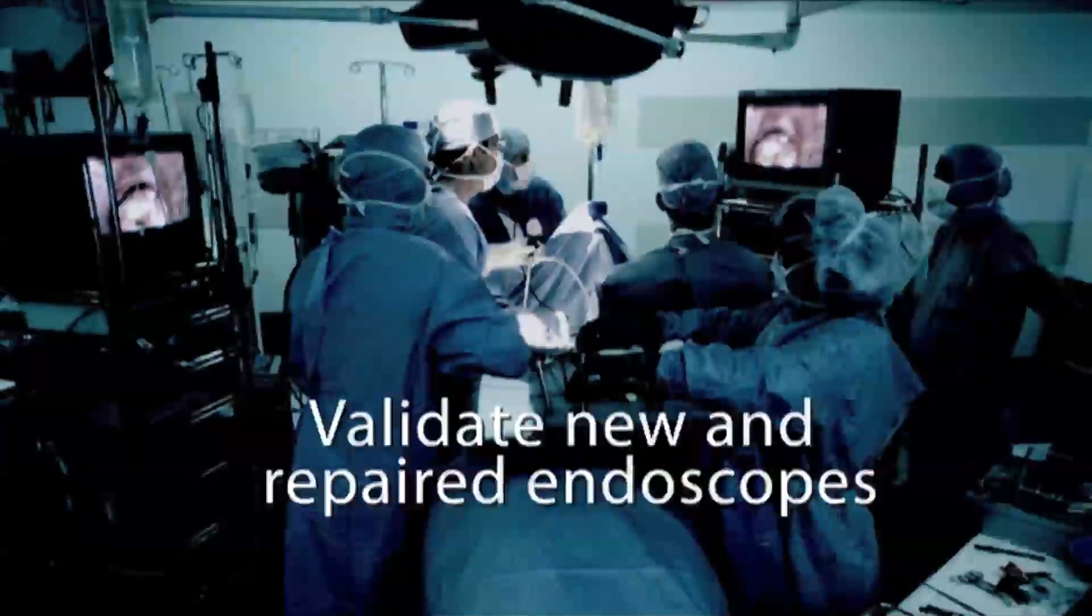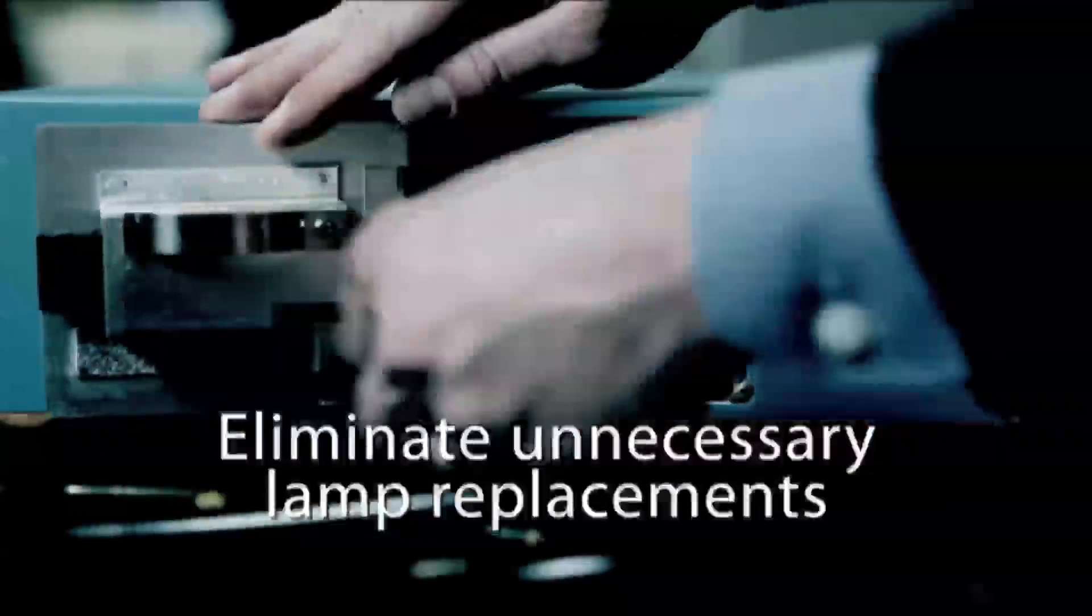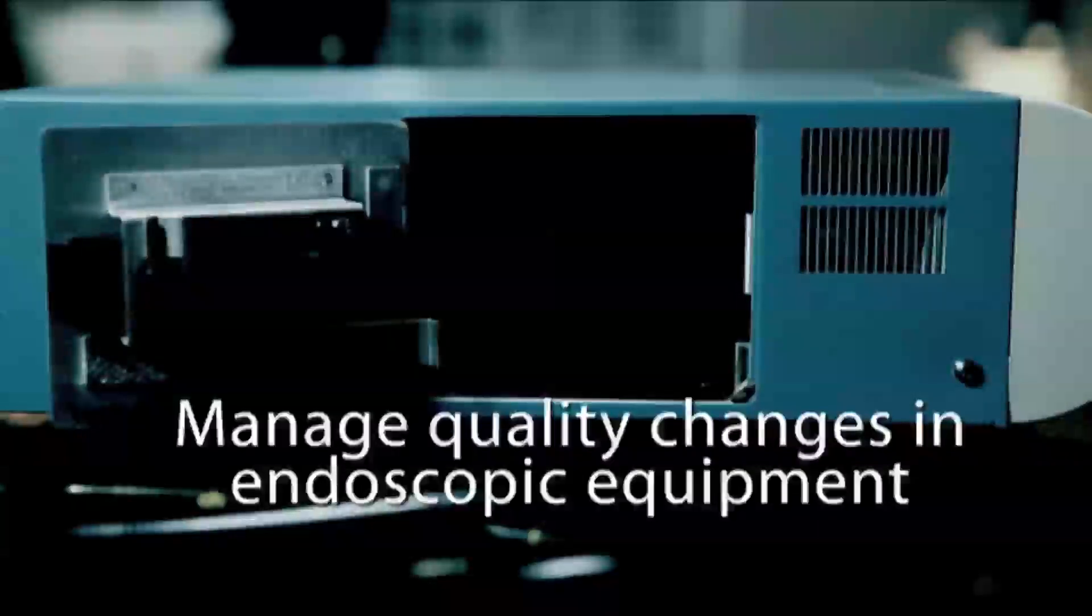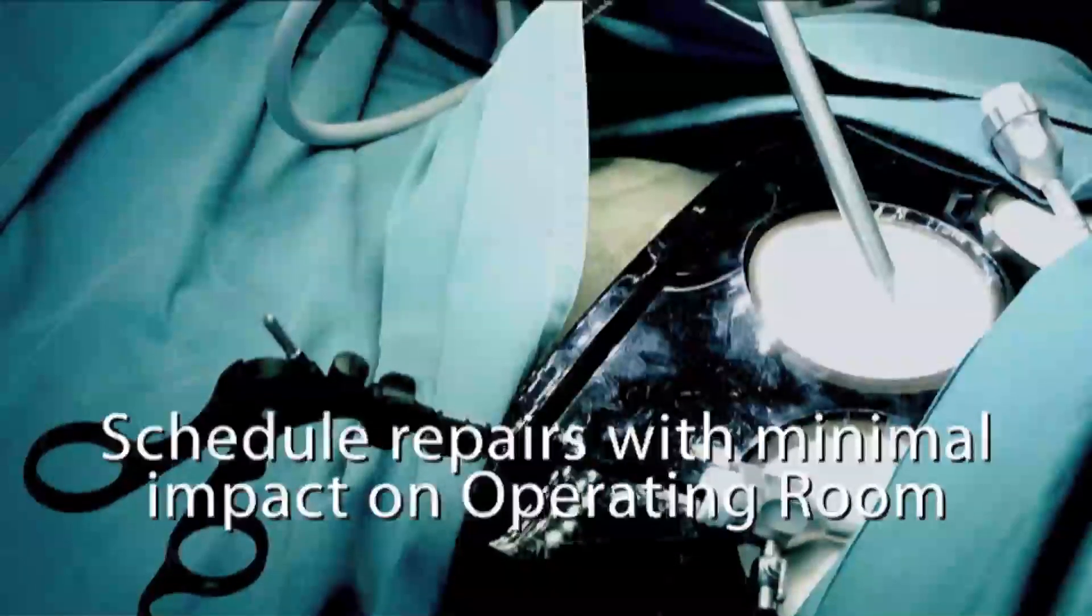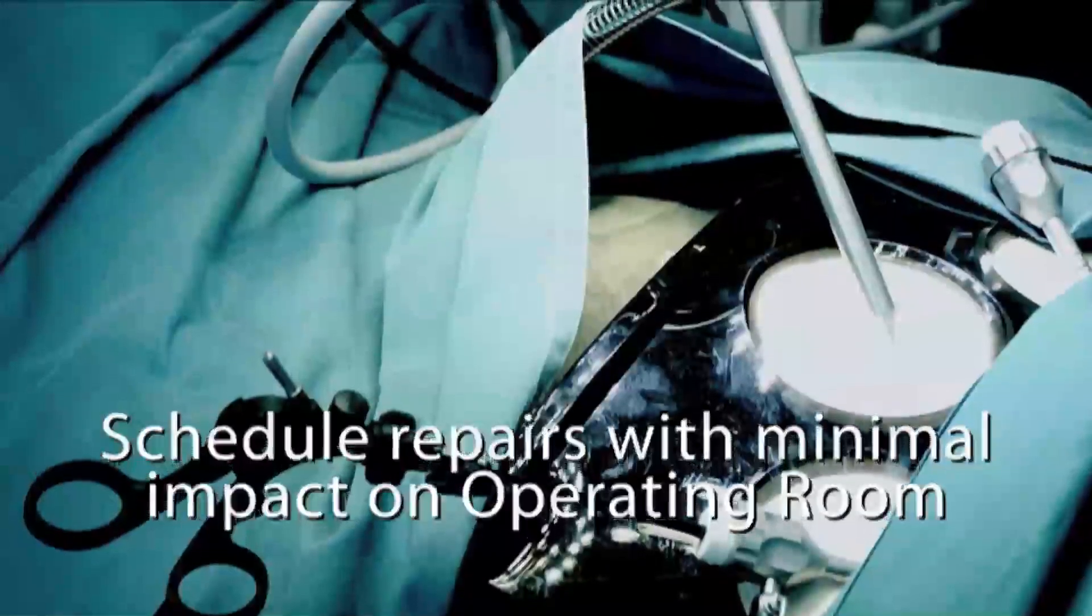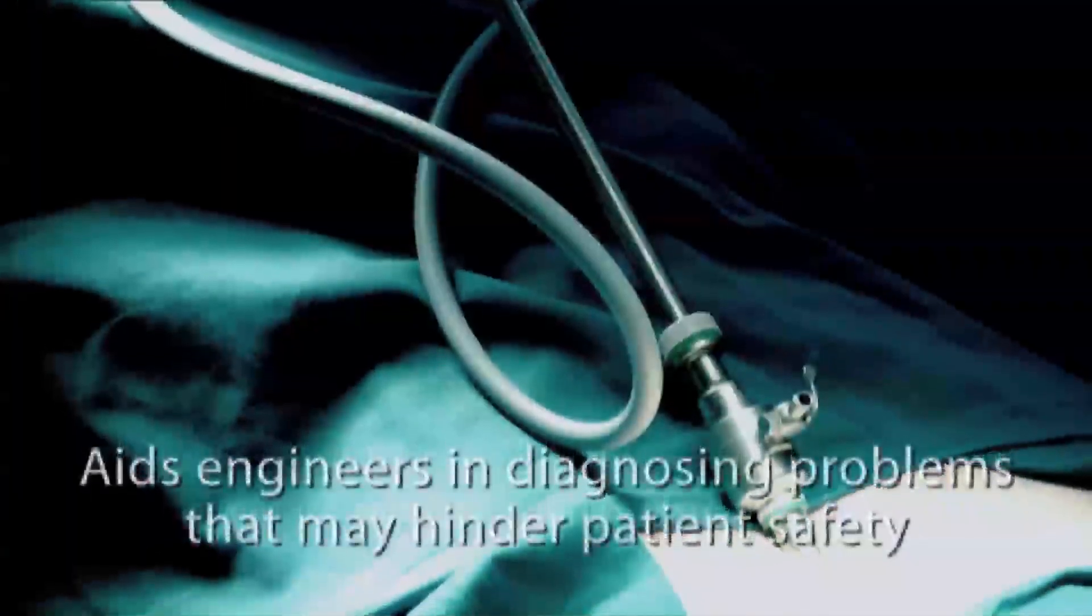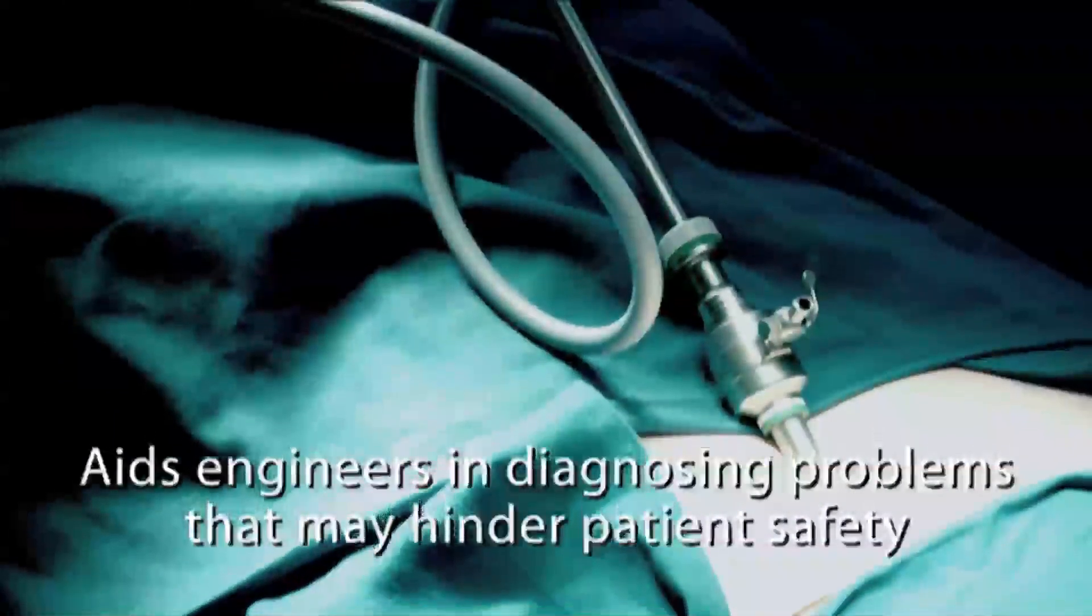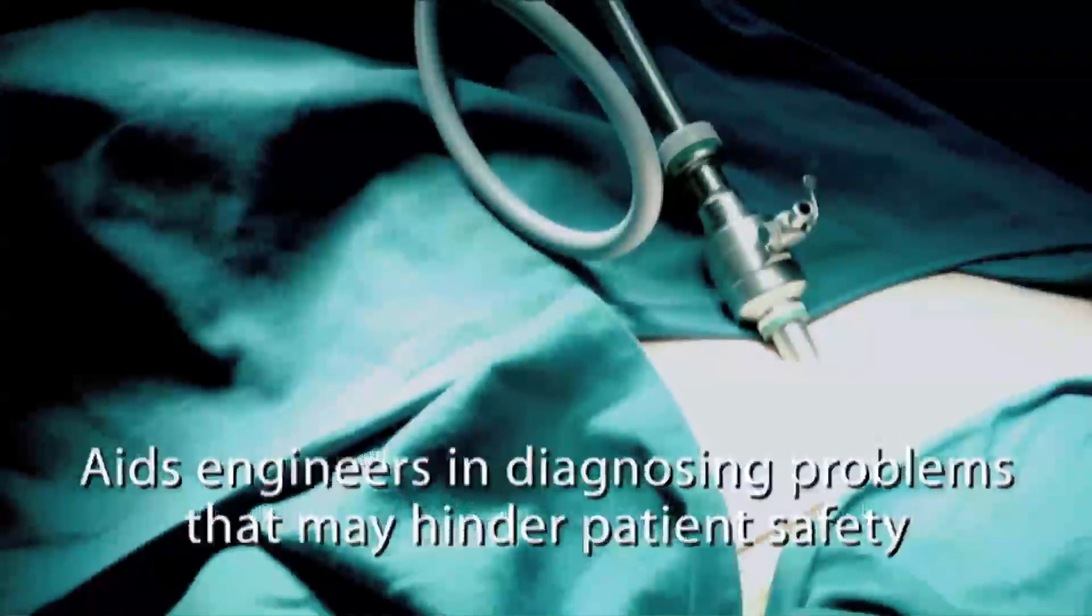The device can validate new and refurbished endoscopes, eliminate unnecessary and expensive lamp replacements, verify equipment performance before and after repair, track equipment performance to schedule maintenance and repairs with minimal downtime, and help biomedical and clinical engineers identify problems before they become a burden on the OR schedule or impact patient safety.